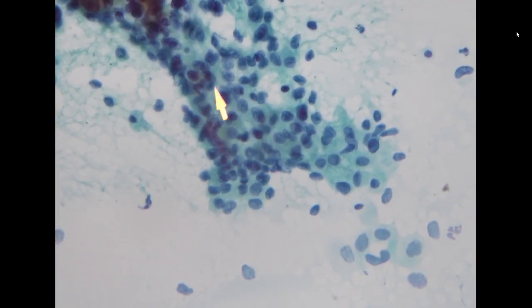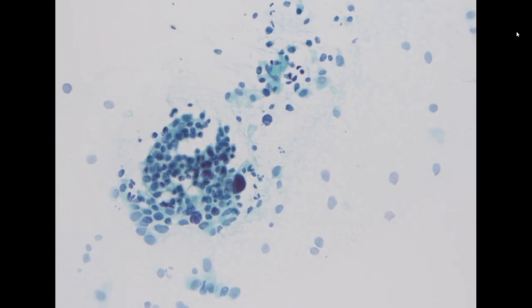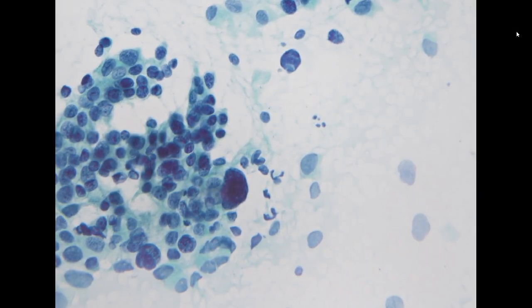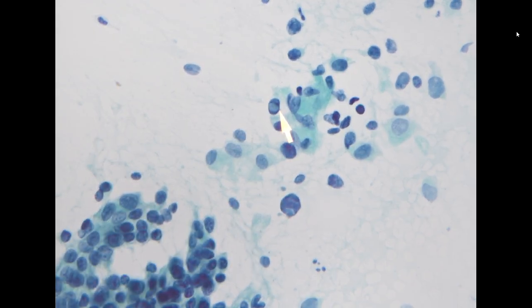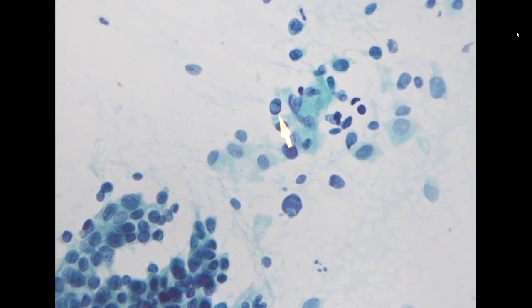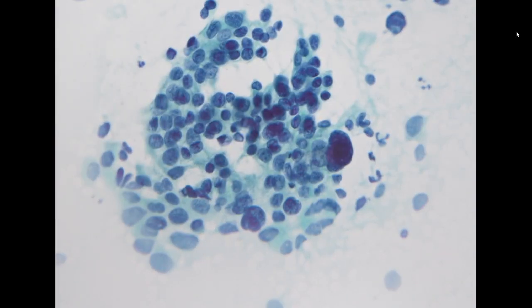But here, there was still a little bit of a glandular feature. So here you see more cytoplasm and the glandular architecture. And the other thing that I want to show is that in primary lung adenocarcinoma, it is not uncommon that you will find pseudo-inclusion in the cell, because normal, activated pneumocytes will show pseudo-inclusion. So it is not uncommon to see pseudo-inclusion in lung adenocarcinoma.